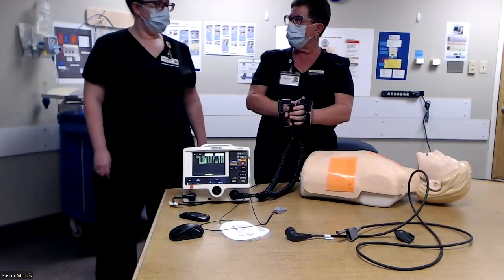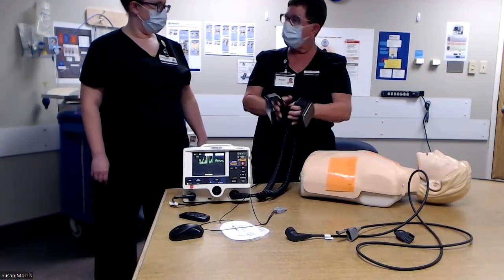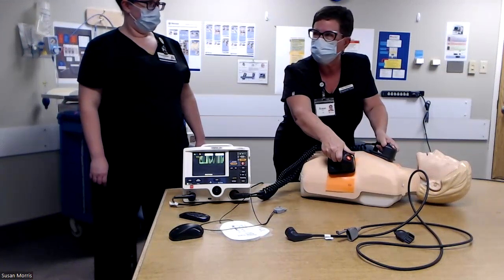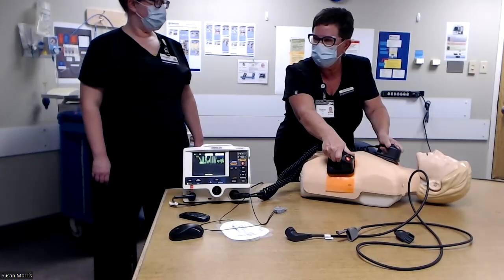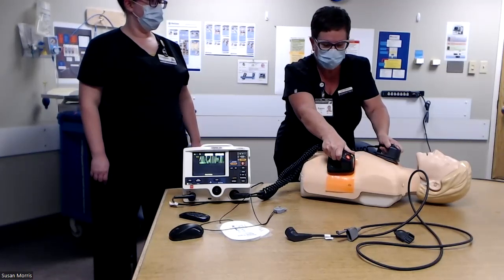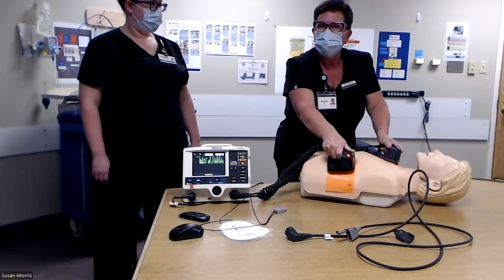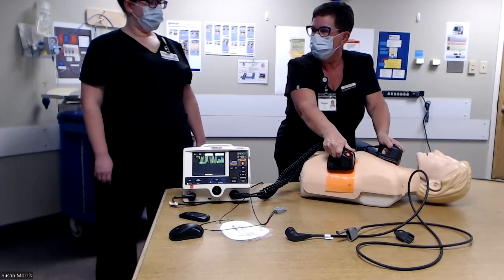For how much pressure do you need to apply to successfully deliver the energy? Great question. In a perfect world, 25 pounds of pressure is what is needed. You do the best you can with what you have. The taller you are, the better ability you have to apply that pressure.